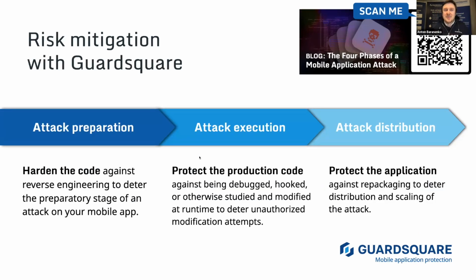Okay, that was a long part discussing the why aspect of this. Now, what is the how, right? What we propose, and what we at Guardsquare do and recommend all device manufacturers to do as well, is to adopt application protection at all stages of the SDLC.